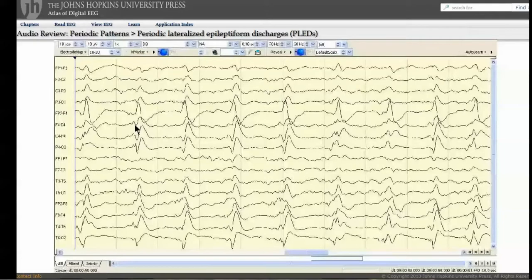Pseudoperiodic lateralized epileptiform discharges are seen in close temporal proximity to clinical seizures. More than 50% of patients with PLEDS will have had a seizure shortly before this recording, or may well have a clinical seizure in the subsequent hours to days. The most frequent clinical correlations of PLEDS appear to be structural abnormalities with intercurrent metabolic or infectious problems. A typical structural cause will be a stroke and less frequently an abscess. Typically, uremia or a urinary tract infection will accompany the stroke, and in the setting of a tonic-clonic seizure, there may subsequently be PLEDS that occupy minutes, hours, or even days afterwards.